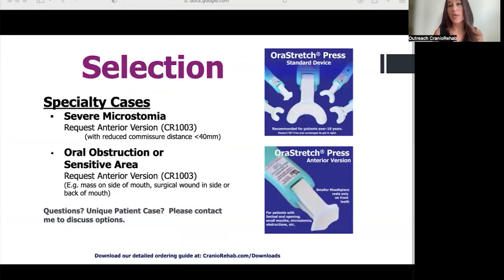In the Clayton, Wart, and Mates research article, Full Thickness Facial Burns, Outcomes Following Orofacial Rehabilitation, patients utilize the OraStretch Press and similar devices to increase vertical opening of the mouth. They found that for patients with full thickness burn, therapeutic intervention was beneficial.